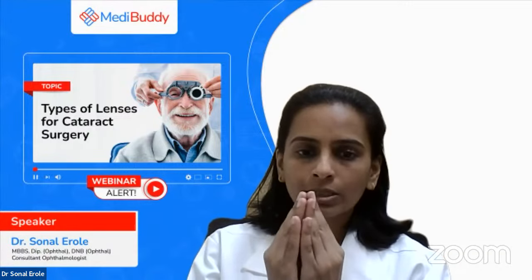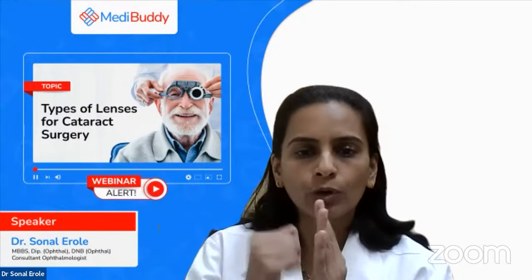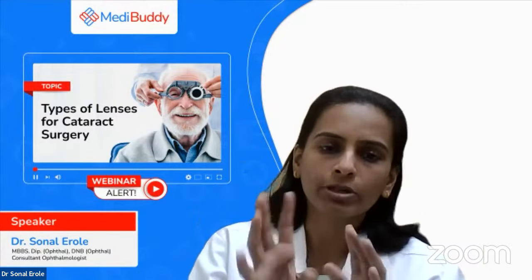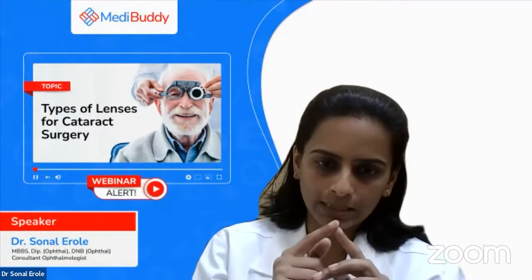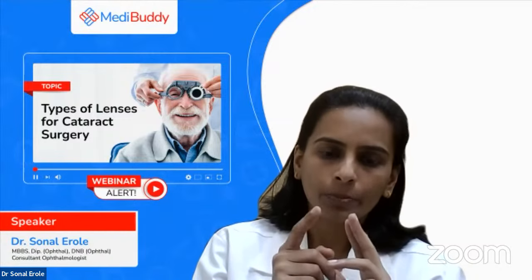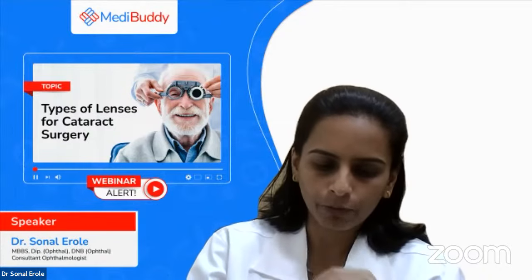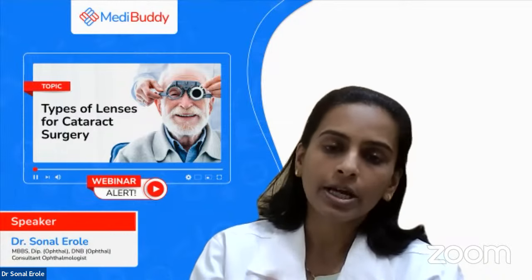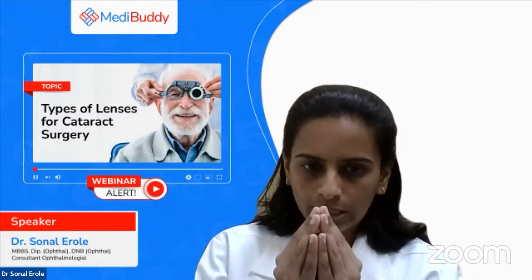When you remove this natural lens and put in a monofocal lens, you can see better for the distance, and for near vision you will wear glasses, just like you wear glasses for presbyopia after 40. They are used for reading purposes, and for females working at home, for small works which require near vision. For that, they will need to use near vision glasses. So this is the monofocal lens.